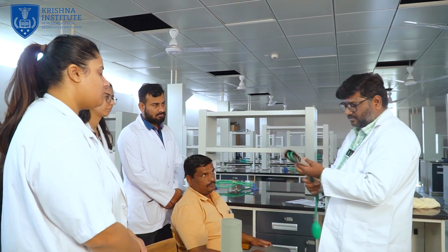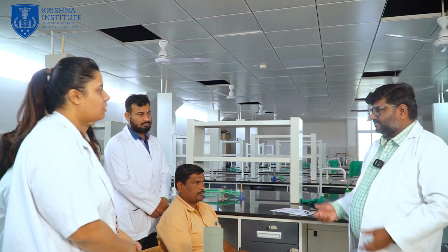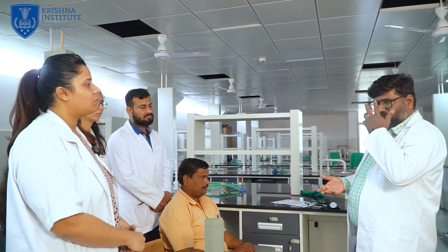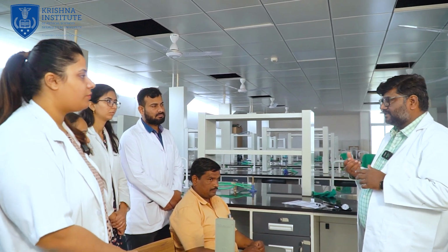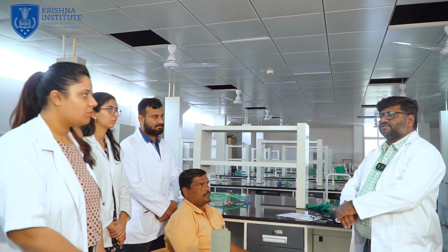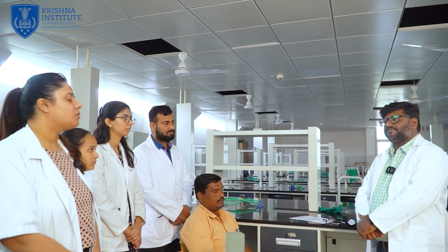You are supposed to always thank. Okay, sir. About the consent for basic procedures like BP, we just require verbal consent. We don't need any written consent for that, right? For basic clinical procedures, we are doing it only for the purpose of the patient. So verbal consent is enough for any examination. That's all for your OSCE examination of blood pressure measurement.